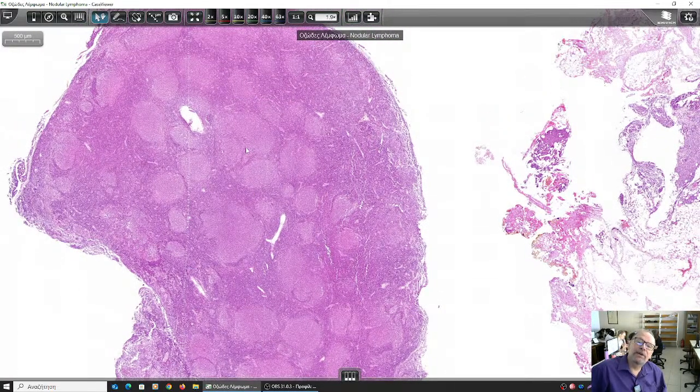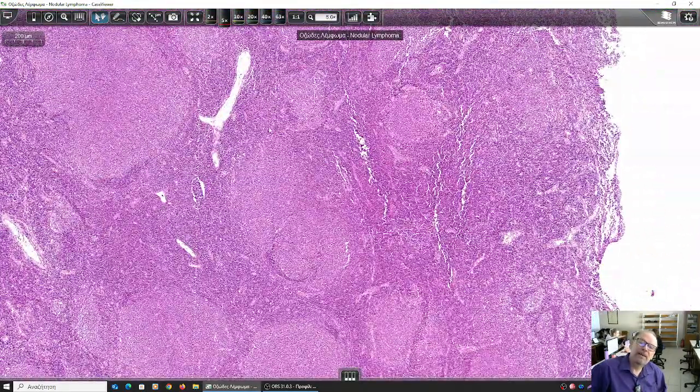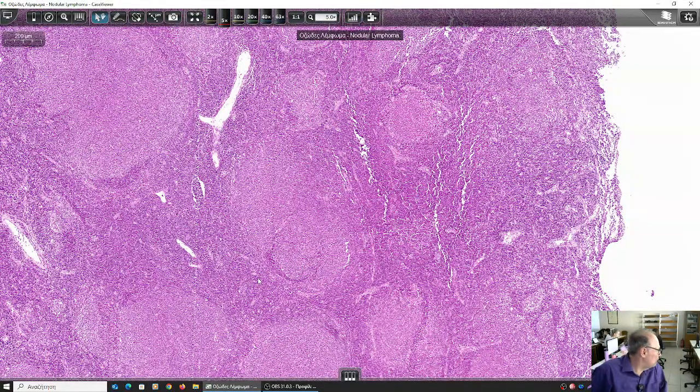What do these appear to do? This one with this one. This one, have a look at these two. This one and this one. What do they appear to do? They appear to merge one with another.